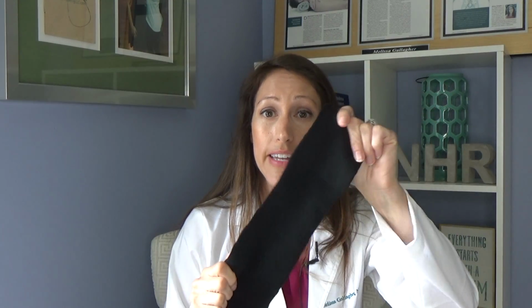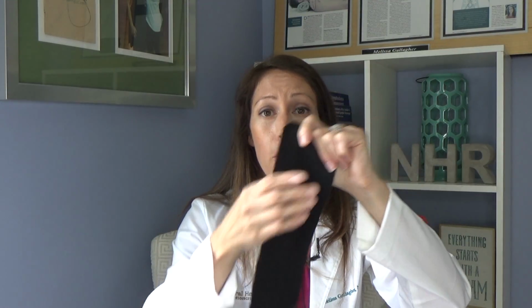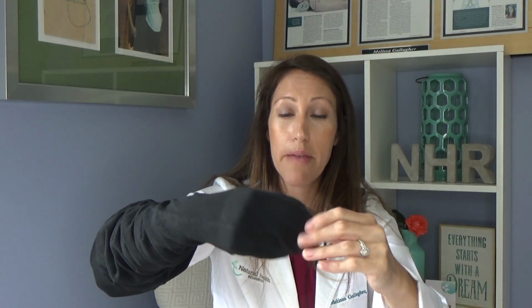You're going to be having a stockinette or stocking that has a compression that has some sort of silver banding or antimicrobial aspect that you directly put your leg into. So literally, folks that get into this, it goes right on the leg, and it's like that. So it would cover the feet, which is great because a lot of times feet are not involved, but we want to compress so that we don't flush fluid into the feet. So this type of compression is very impactful for the lower grade levels of lipo-lymphedema, lipedema.